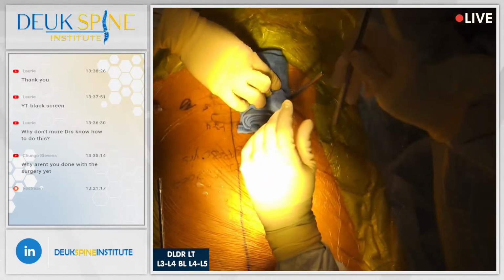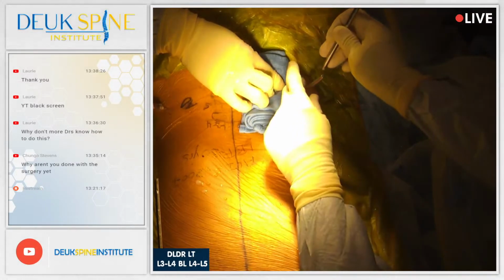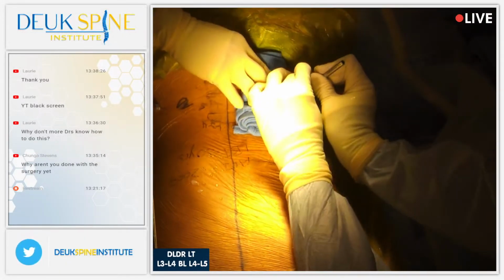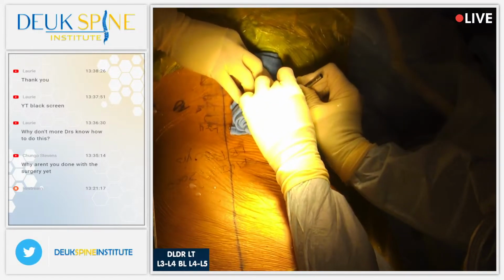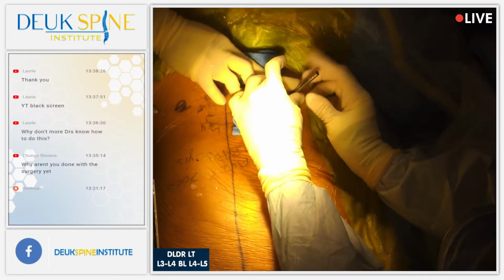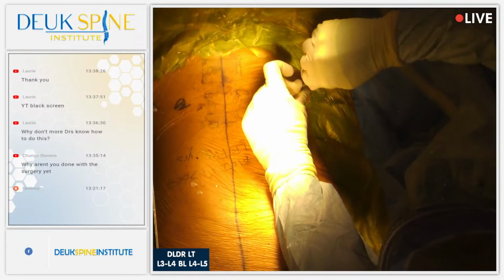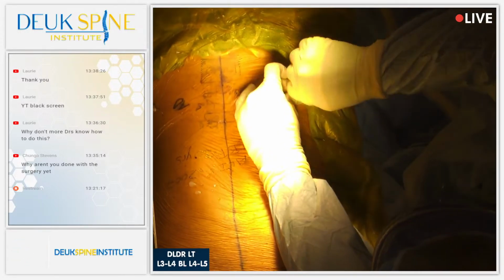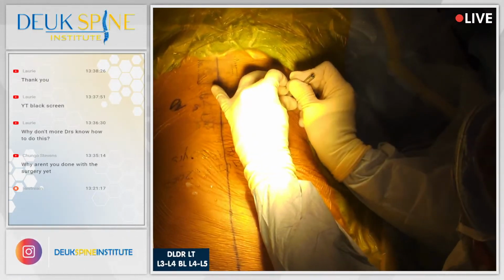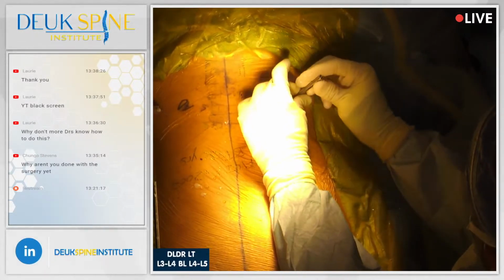Hey, can I have another guide wire, please? The guide wire wasn't the issue for me. It just slipped. See, no, one second, one second. Maybe with a towel. Can I have a towel? Let me have the tube.